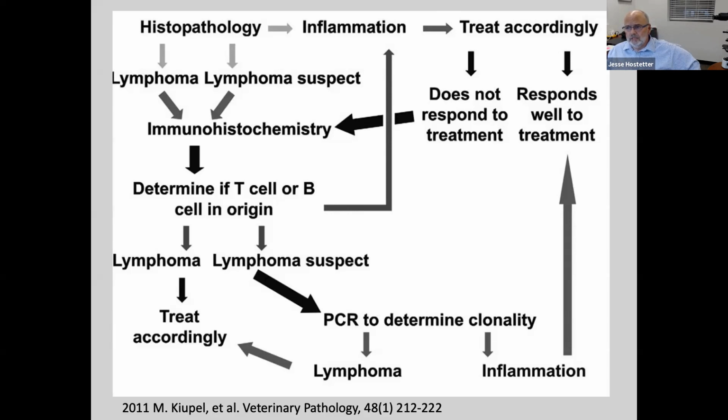You know, some of the cases are difficult to tease out what it is, and some of them are very straightforward. I think with that, it's a little after 8:30, and I promised I would stop after about an hour and a half, and that's where we are. And so that's where I'll end, and I'll take some questions.